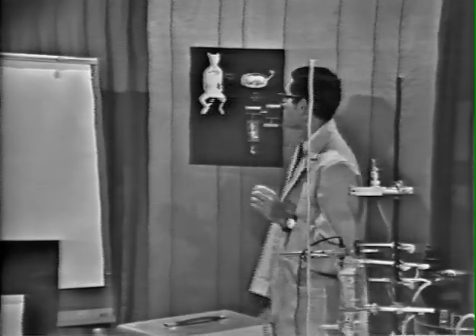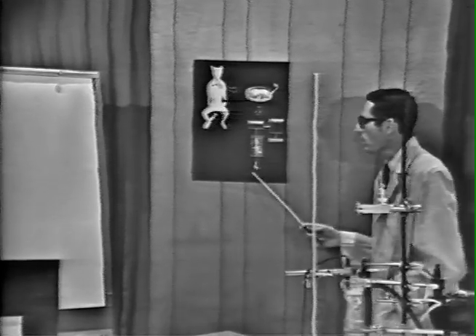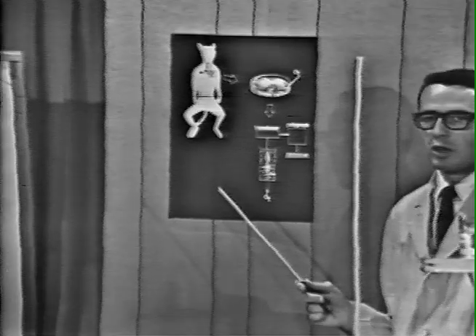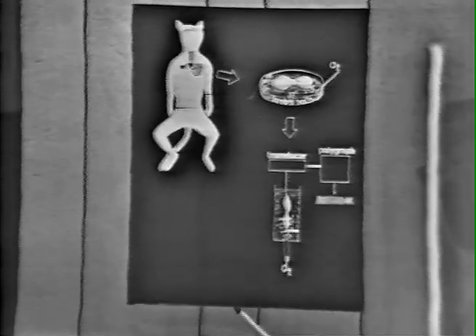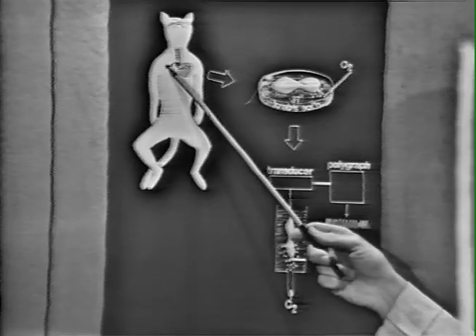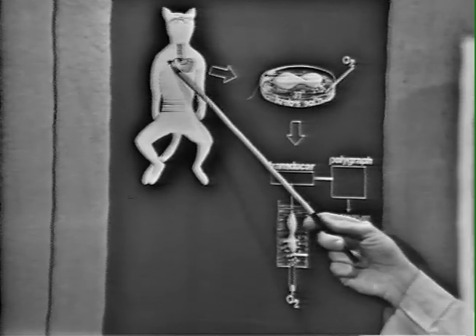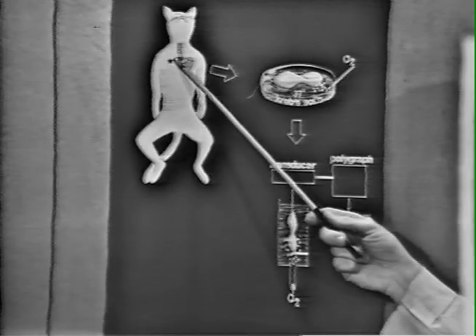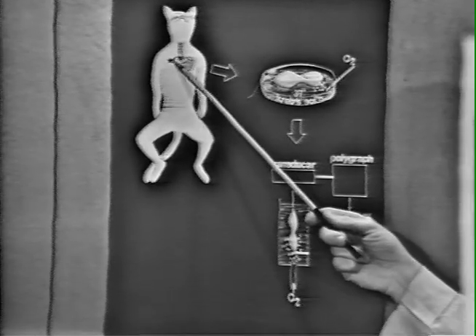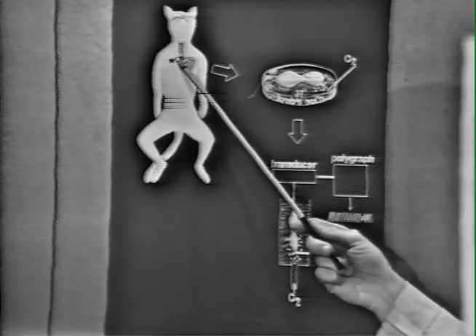We have a schematic representation of the experimental procedure. We anesthetize a cat with Nembutal and then open the thoracic cavity and expose the right stellate ganglion, which is situated at the head of the first or second rib. Coursing from the stellate ganglion is the cardioaccelerator nerve, which travels to the peritracheal plexus, there joining the vagus nerve, and then innervates the atria and portions of the ventricles.